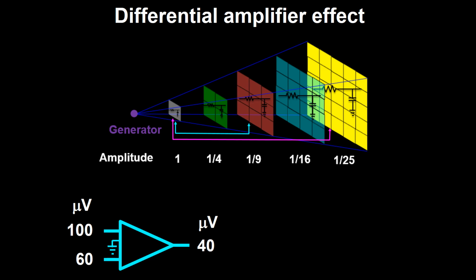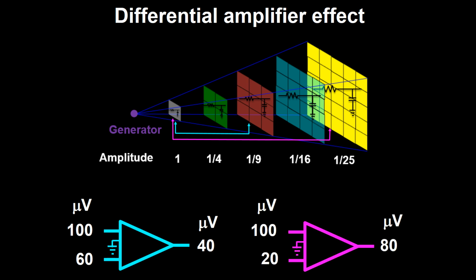is that the wave going out from the amplifier, that is the amplifier output, will be of a lesser amplitude when the electrodes are closer, as they are depicted by the side of the aqua differential amplifier, than when the electrodes are at a further distance as represented on the side of the magenta differential amplifiers. Please take a few seconds to look at this number. I think it would be better understood if you do so.